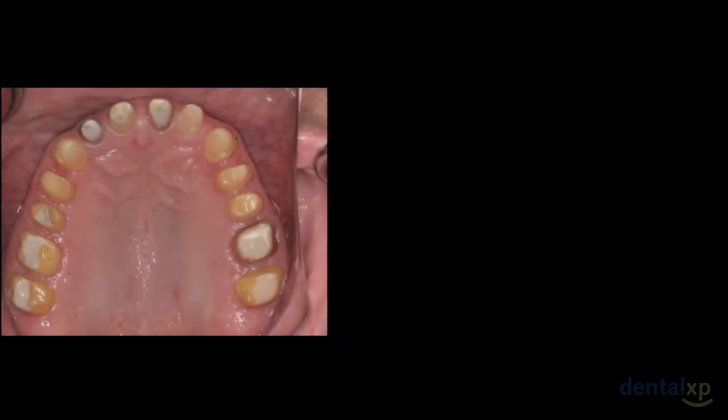This is the day of the reline. The reline takes about 4 weeks to come about because that's the period of time for the tissue healing. The only procedure that should be done at the reline appointment is to close the existing margins of the provisionals in place so they fit the tooth surface.